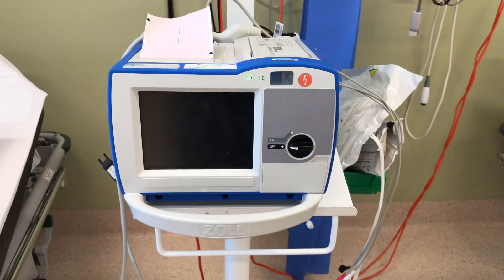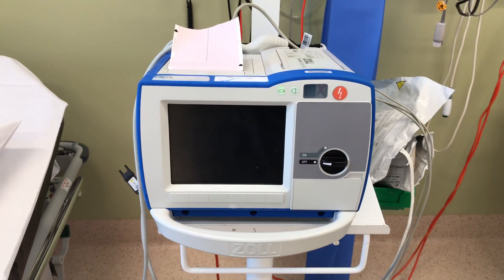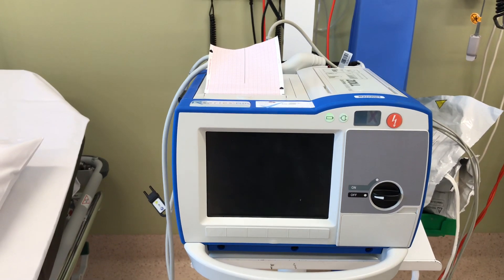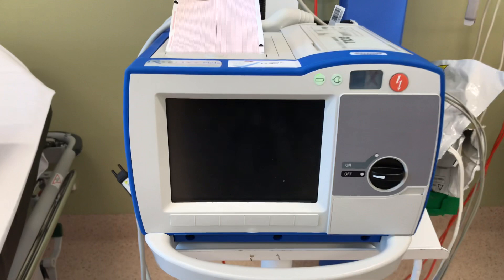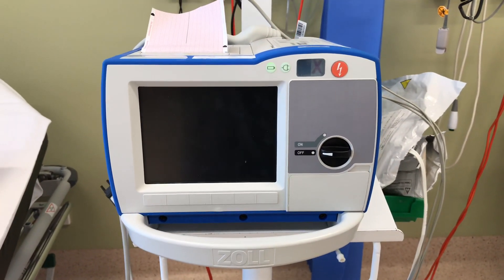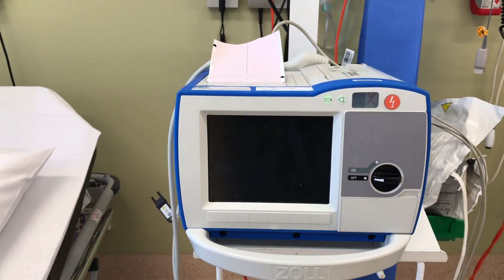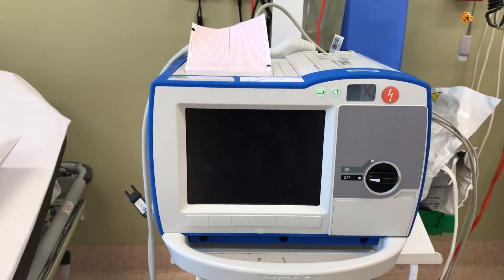Hey guys, this is a short video on how to do a calibration or a test on our new cardiac monitor defibrillator device, which is the Zoll R Series Plus. This information was shared to me by the ambulance educator Josh King. I have given a bit of orientation on how to do the test to the staff who attended ALS practical testing with me.